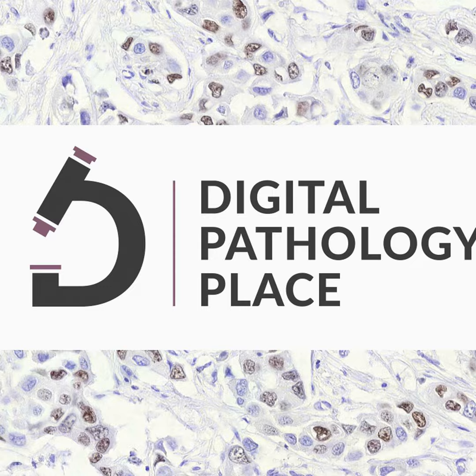So we presented an argument to the FDA that the two scanners, the DP200 and the DP600, were identical by design, even though they were actually manufactured a few years apart. They make the same file type, and they have the same so-called pixel pathway. We'll go into that in a little more detail. At the time we got our clearance last summer, it was the fifth overall whole slide imaging system clearance with a novel scanner. I'll explain what that means in a moment.